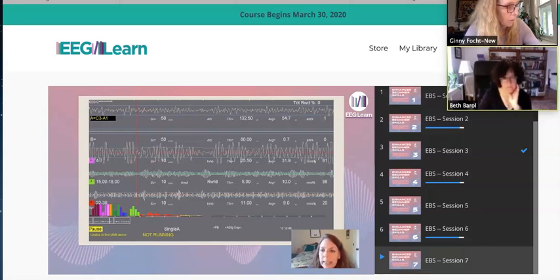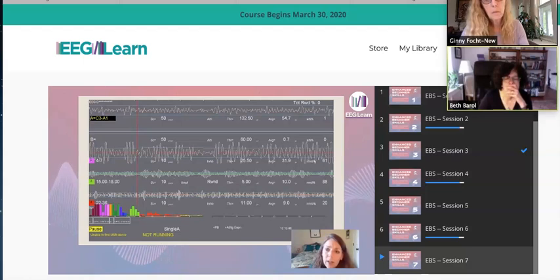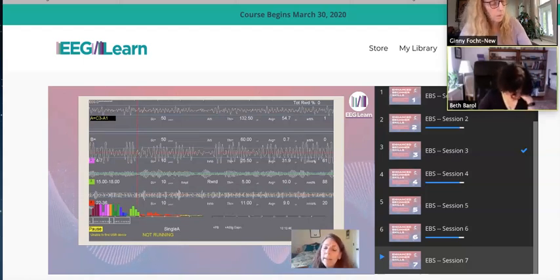So if 65% threshold on your reward band is a moderate challenge level, we have lowered the hurdle so that more of this person's body is above it. If you lower a hurdle, that makes the obstacle easier. So a higher percentage on your reward band means that threshold has been set at an easier level.